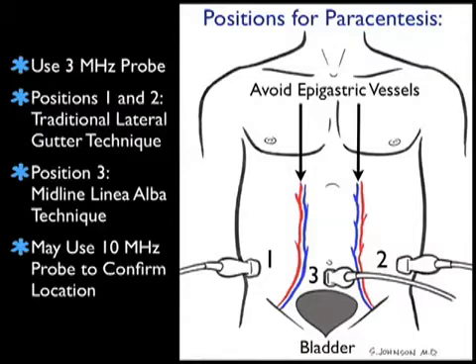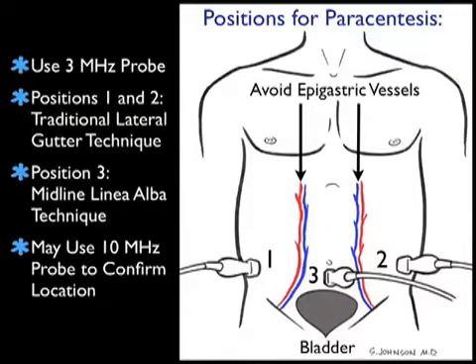We can also use the 10 MHz higher frequency probe to get a better look at the abdominal wall in relation to the bowel and ascites fluid prior to our puncture attempt. In fact, this will give us a more detailed look into the abdominal cavity to better plan our approach for the paracentesis procedure.